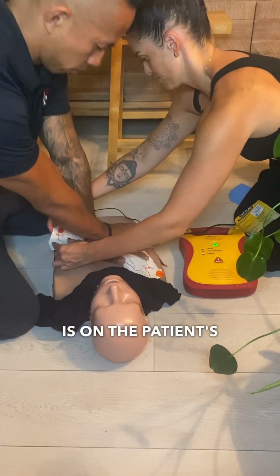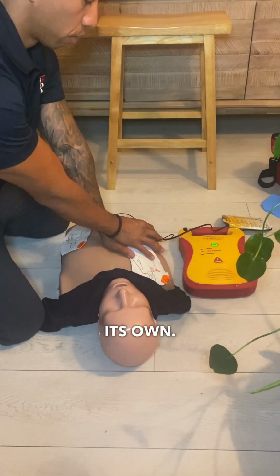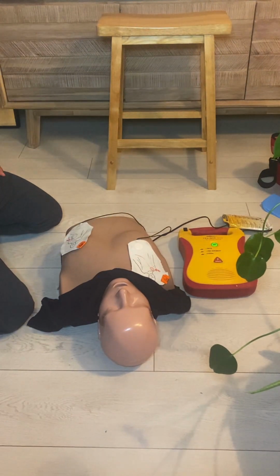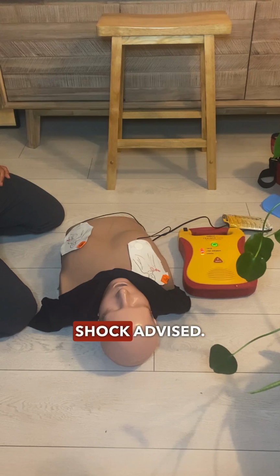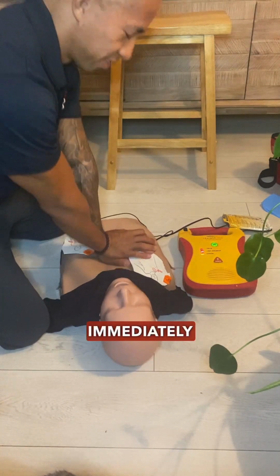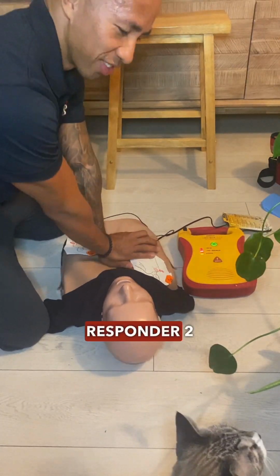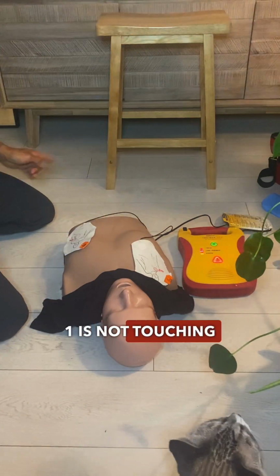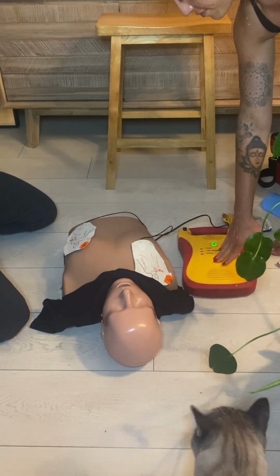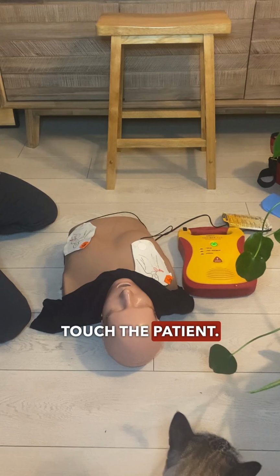Once the AED is on the patient's bare chest, the AED will automatically analyze on its own. Do not touch the patient. Shock advised. Once the AED found a shockable rhythm, immediately start compressions while the AED is ramping up. Responder 2 ensures responder 1 is not touching the patient before they push shock. Shock 1 delivered. It is safe to touch the patient.